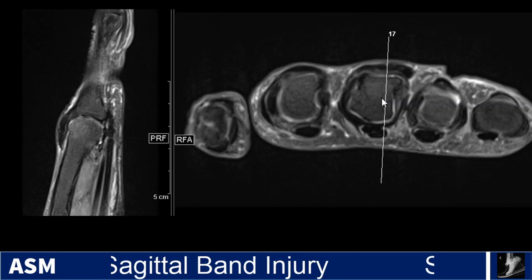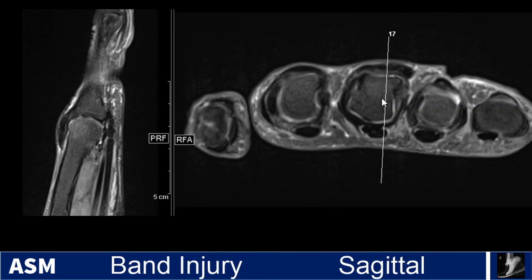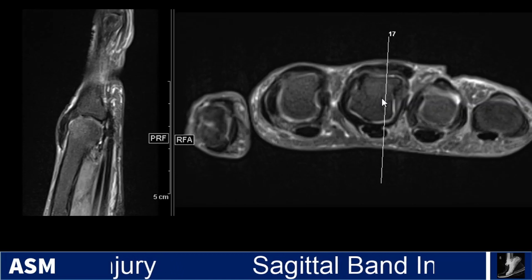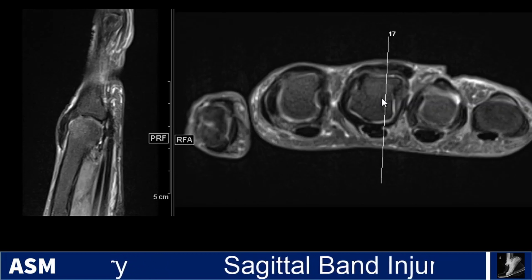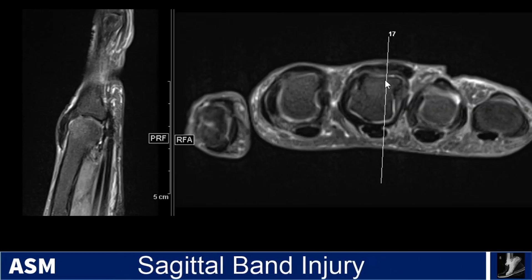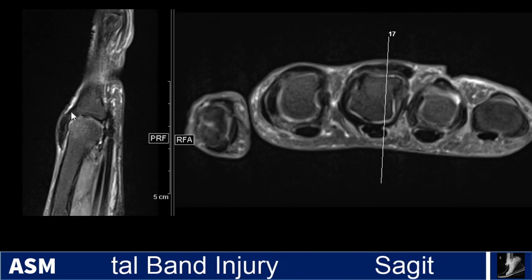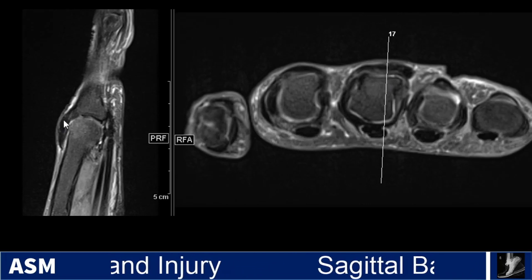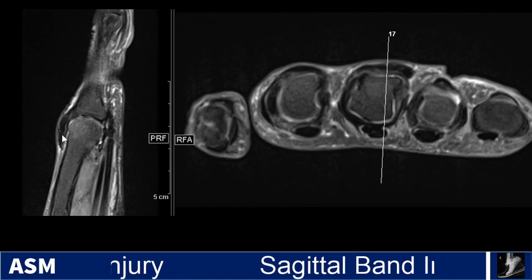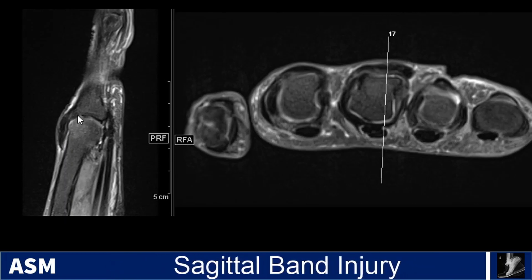I don't have a full clinical history in terms of the mechanism of injury to this patient, but there was some sort of injury that happened while she was either going to the hospital or while she was hospitalized. Right away, if you look at this sagittal image, you can see that there is significant soft tissue thickening along the dorsal aspect of the MCP joint here.